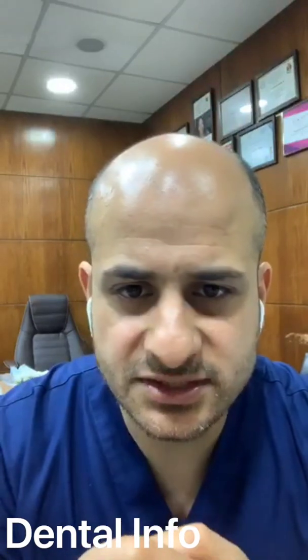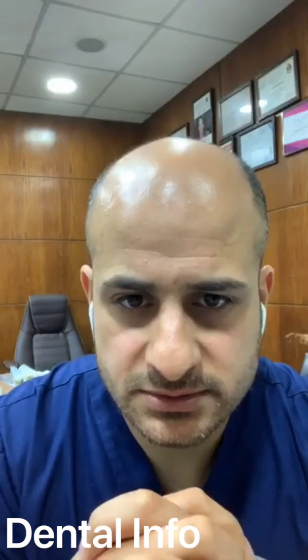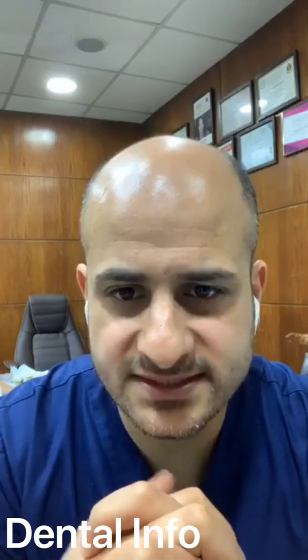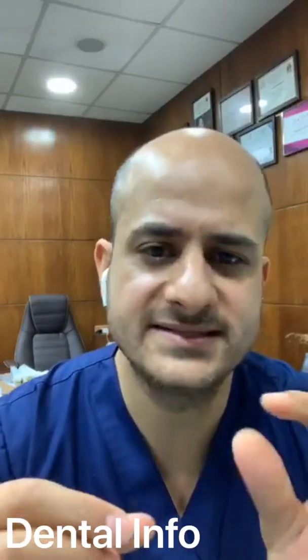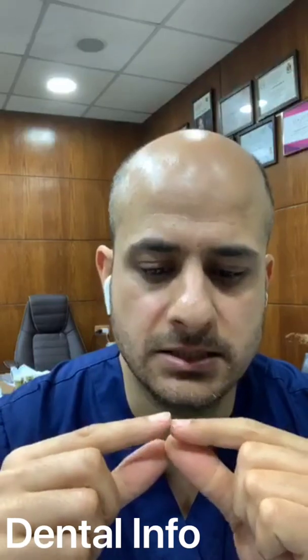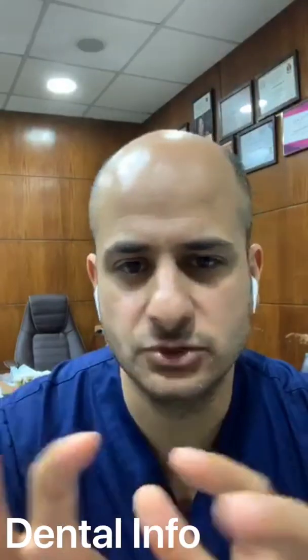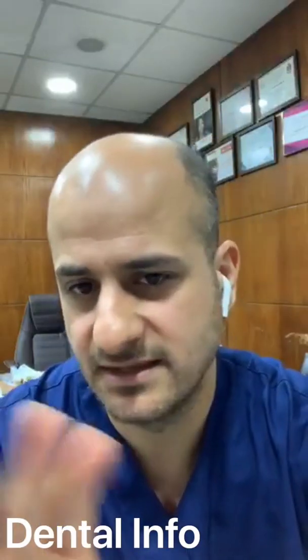Can we use 90% alcohol to disinfect gutta-percha? I have here sodium hypochlorite takes time to disinfect. Okay, what's the problem with alcohol? Alcohol makes the cone very tough, very dry, so it will break easily. So do not use alcohol. I don't recommend it. But if you have literature supporting that, you can use it, of course. But for me, I don't prefer to use alcohol because it will affect it negatively.